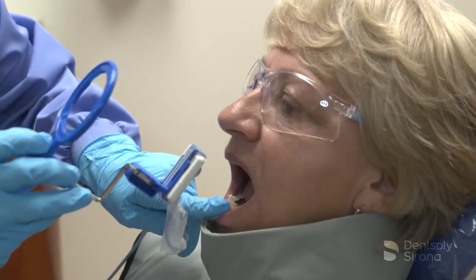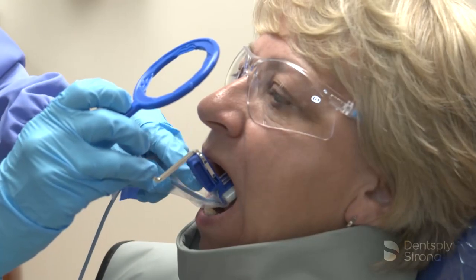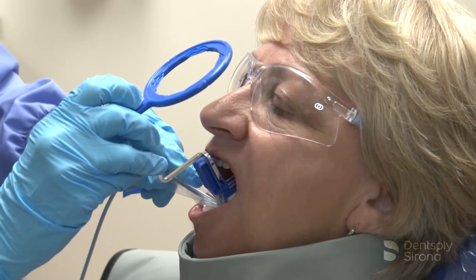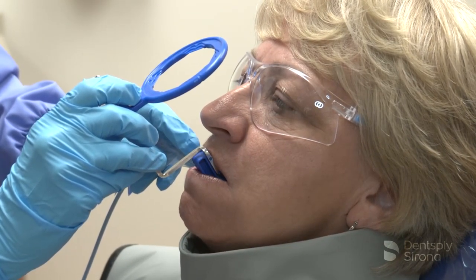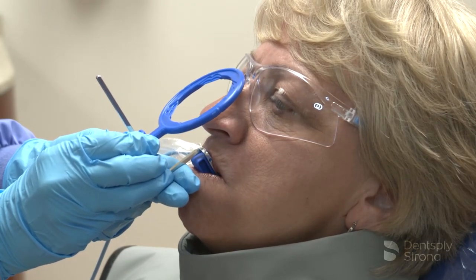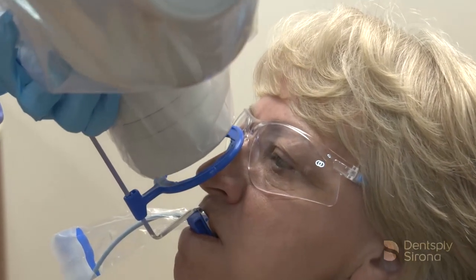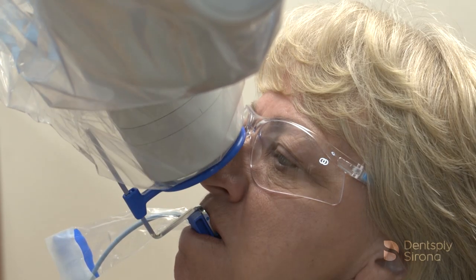To begin the prescribed full mouth series of X-rays, center the sensor behind the maxillary central incisors and position it in the center of the mouth. Place the center of the bite block on the incisal edges of the maxillary central incisors and instruct the patient to close slowly. Once the bite block is in place, slide the aiming ring down the arm close to the patient's face, align the tube head of the X-ray unit in close approximation to the aiming ring and center it. The X-ray image is now ready to be captured.